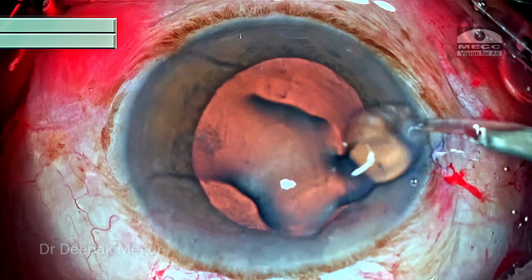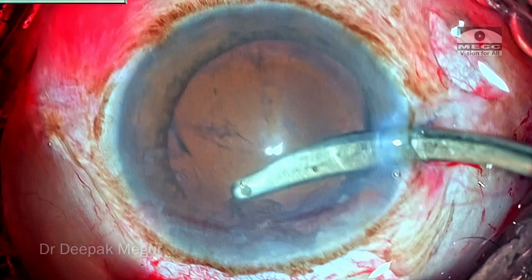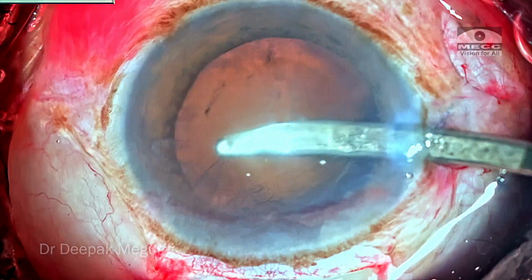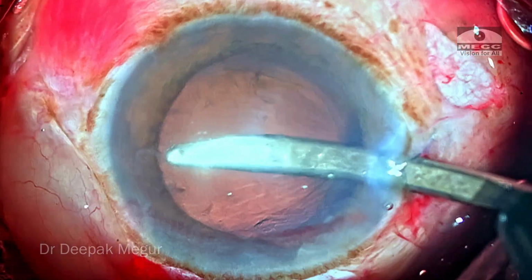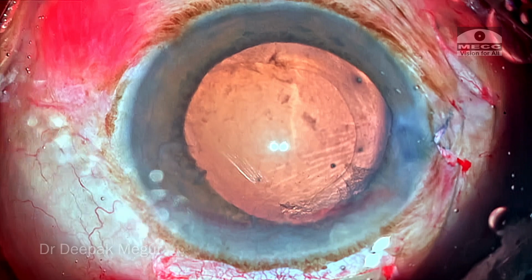So he abandons going to the main wound and tries to go into the side port. And as he's trying to visualize the cortex, he realizes that he needs to tackle the zonular dehiscence, otherwise it's going to enlarge and there's going to be a vitreous prolapse. So he is now planning to place a CTR. Of course, this is being done under the supervision of the trainer himself.